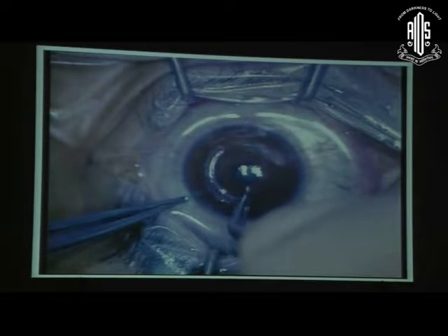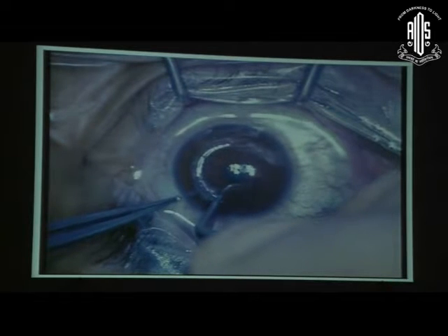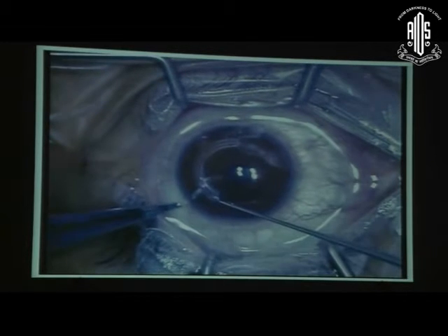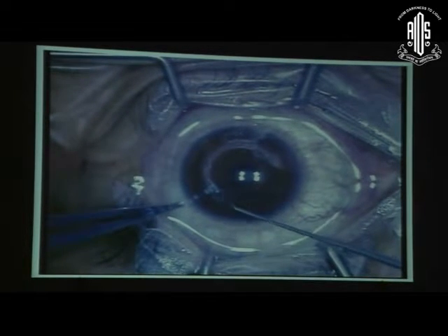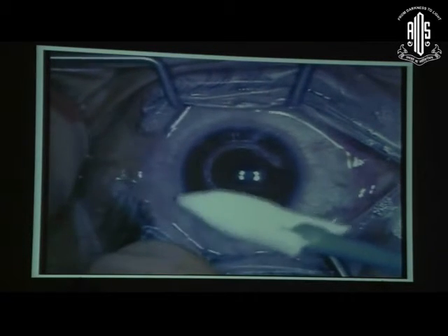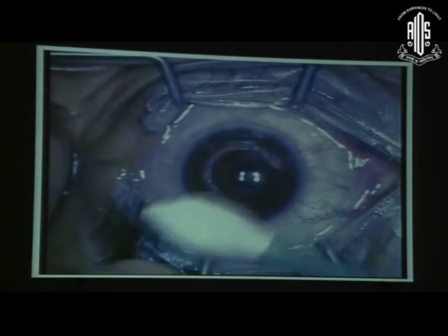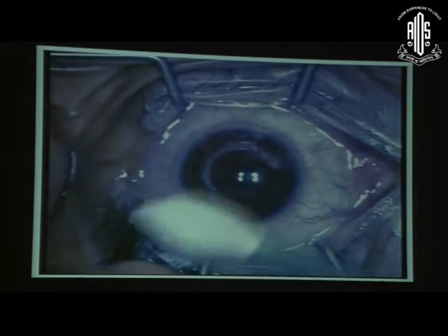And because the incision is so precise and there is not much gaping of the incision, you can even leave it sutureless. So most of the time when we use the femtosecond laser, we don't prefer to put a suture, whereas when you are doing it manually, you usually prefer to suture, because the initial incision opening tends to gape a little, and you don't want any epithelium growing into the interface.